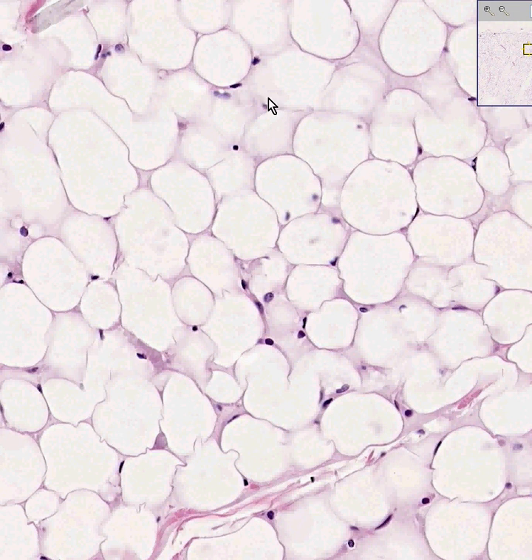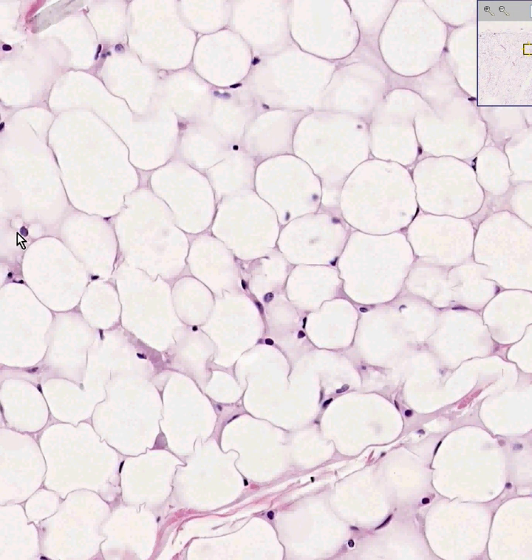So that's probably an adipocyte nucleus. That probably is. That could very well be. Perhaps that's a lymphocyte. Perhaps that's another round cell like a lymphocyte or a macrophage.